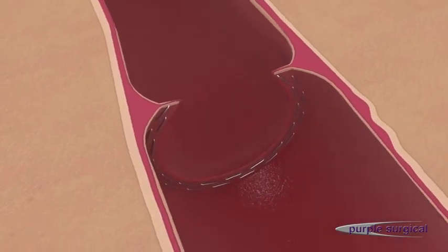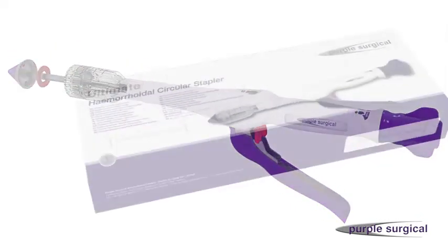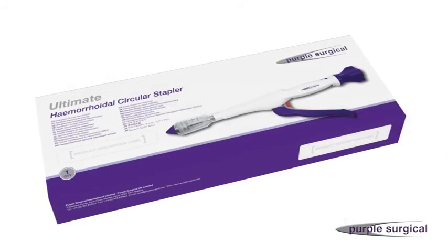To inspect the tissue donut, open the device fully by turning the wingnut counterclockwise. For full directions for use, always refer to the DFU leaflet in the product packaging.